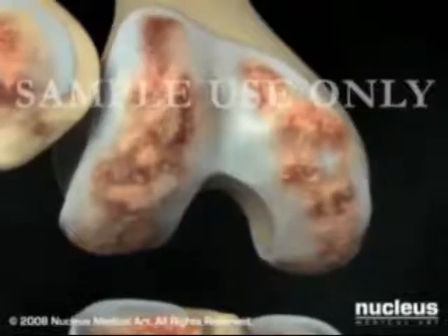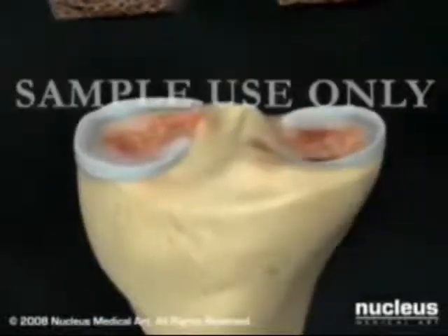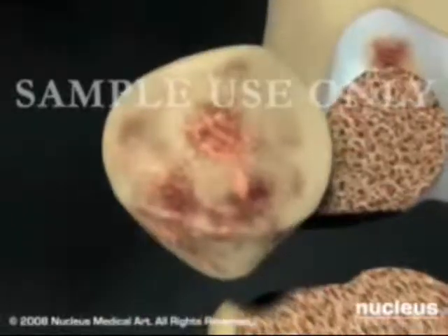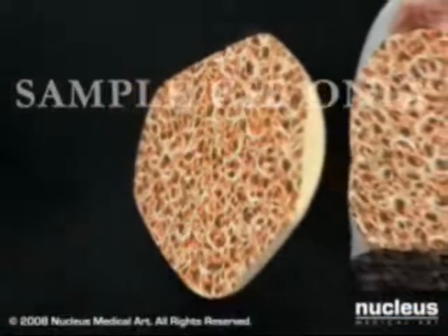Using specialized tools, your surgeon will remove the damaged bone and cartilage on the ends of the femur and the tibia, and in most cases, remove the underside of the patella. Your surgeon will then prepare the remaining bone to receive your new prosthetic knee.